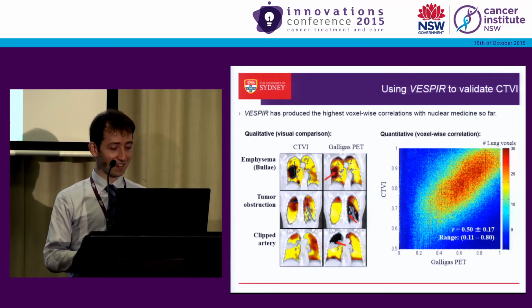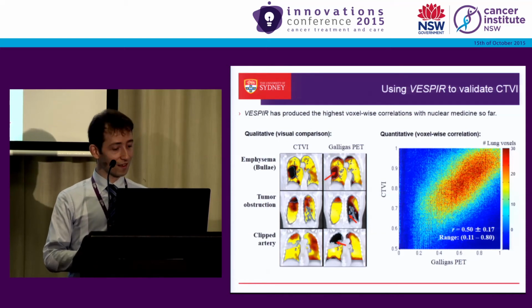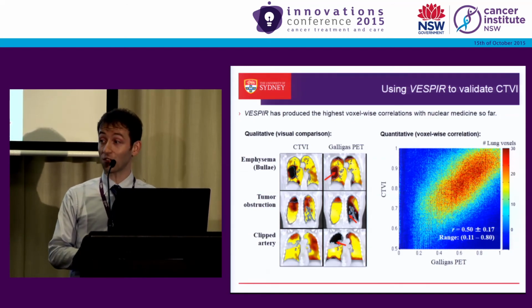And this plot isn't just for one image. This is against 25 patients, 3 time points. The beauty of MATLAB, or any software which you can script, is suddenly you have the power to explore accuracy over a vast amount of data. And we're seeing some really interesting positive correlations between these different modalities.